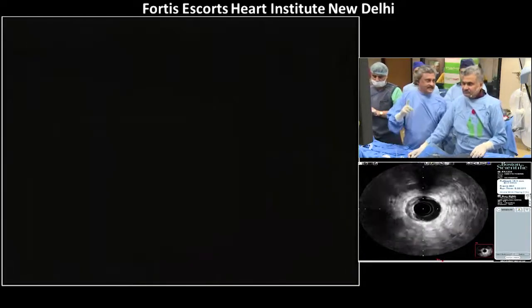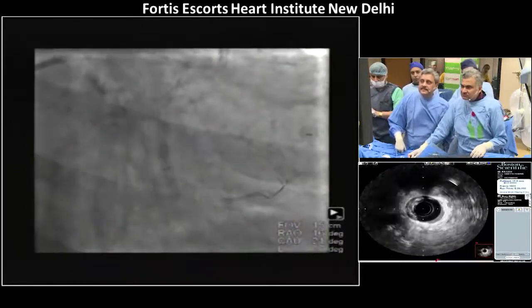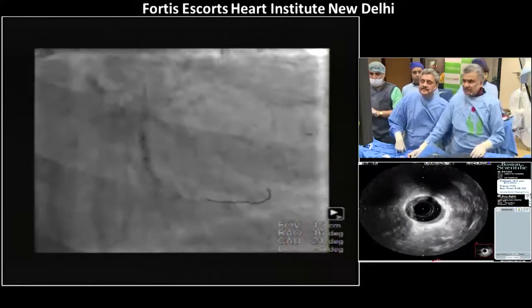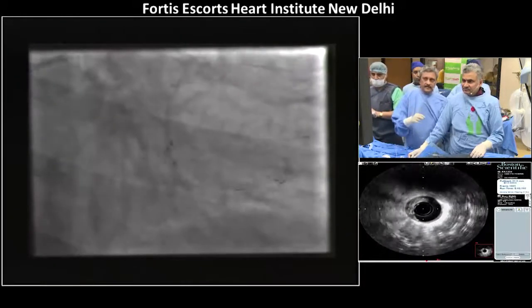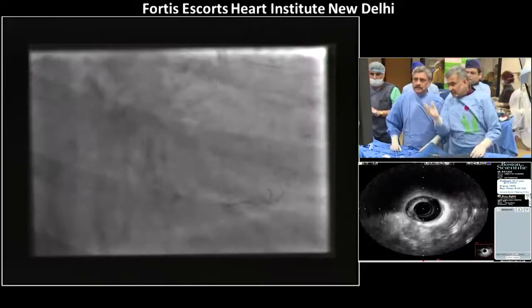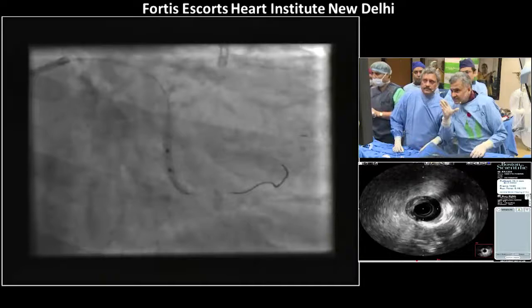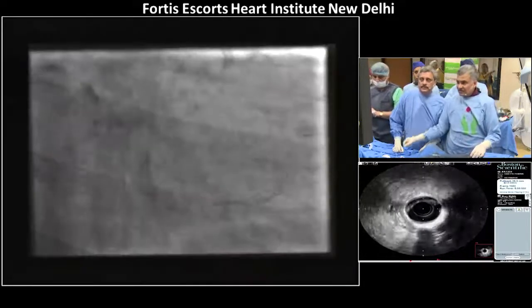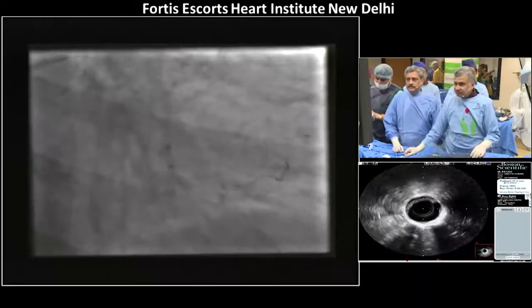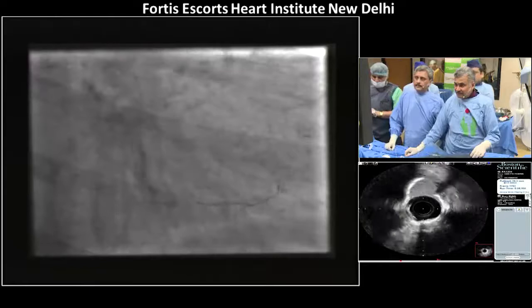Seems better, but there's a little indentation. No, a good indentation is still persisting. I want to take it back a little and then again go up. Still, it's in the middle, the center portion. Change the position of the balloon. You see this? So 27, and hold it for a longer time. 27 and a half, 28.